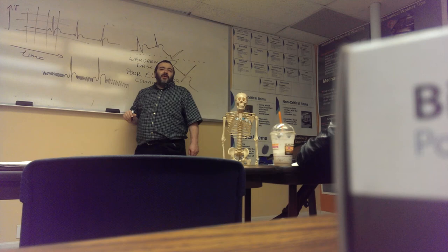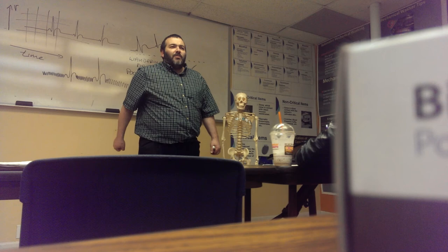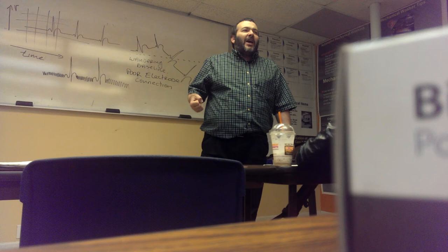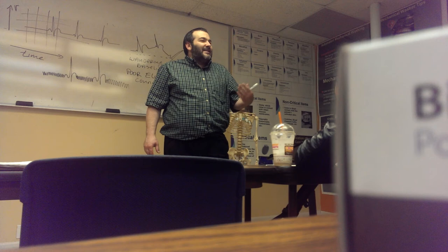Now, I want you to remember, maybe you were a kid and you were watching cartoons, and then somebody at home, usually the mother, went there with a vacuum cleaner and started vacuuming around you while you're watching TV. What happened to the screen? Right? You lost your good reception to your TV. Even with a cable, sometimes when your vacuum was powerful enough, you get static. During an electric storm, you're driving the car listening to the radio. Lightning hits. Instead of music, you hear static, isn't it? Same thing when you do an EKG.